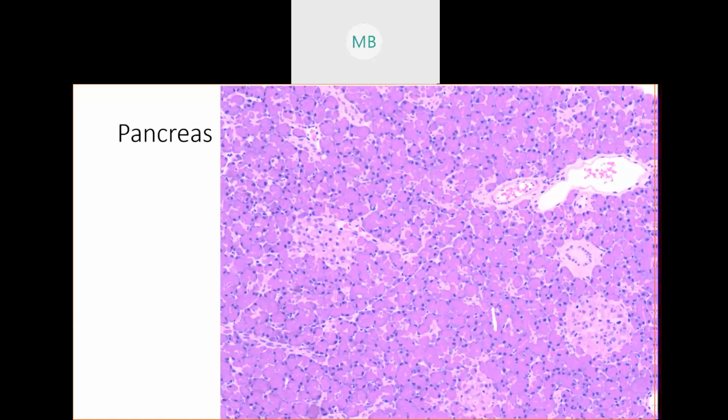That brings us to your pancreas. We only have 3 more glands to go over in this video. Huzzah, guys. So remember, your pancreas is one of those organs that you want to keep happy. Make sure they are pleased and get paid well and taken care of, because your pancreas pulls double duty for you and works full-time for 2 different systems of your body. Right? So your pancreas works full-time for your digestive system, and it works full-time for your endocrine system.